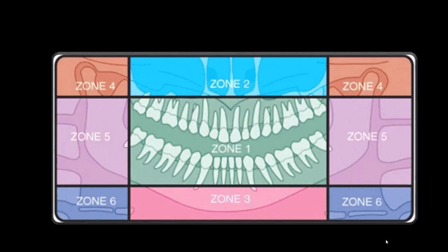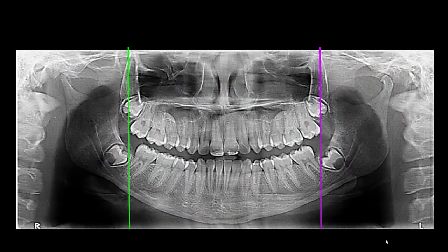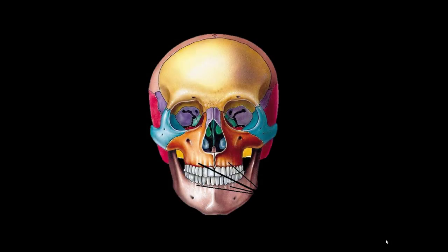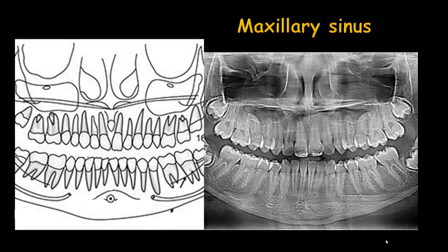If you missed that video, go to the playlist of panoramic and take a peek. Today we're going to talk about zones 1, 2, and 3. These three zones are in the middle — it's like looking at the skull from the front view. Let's start our anatomical landmarks in the front zone from the maxillary sinus.